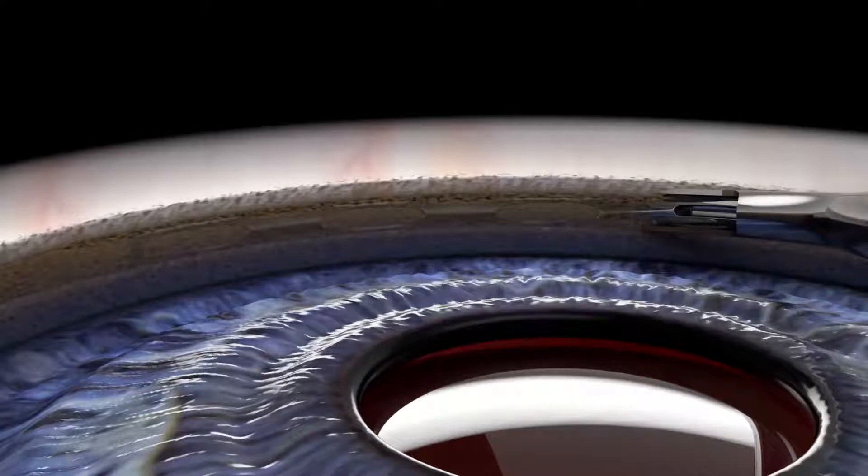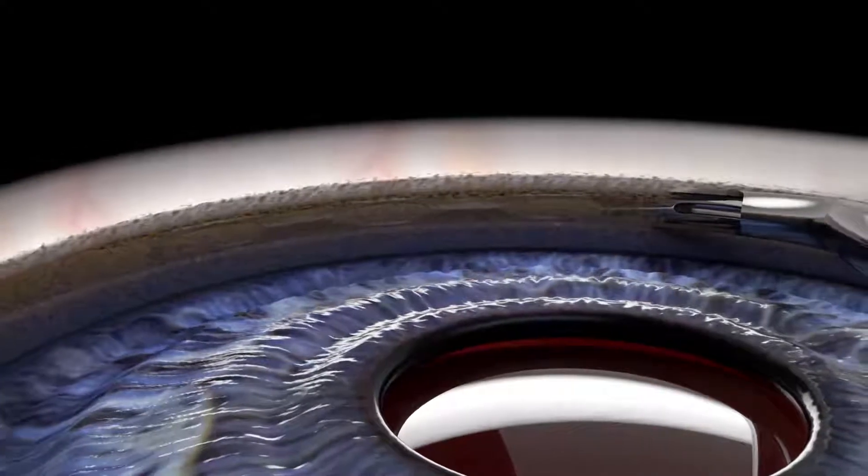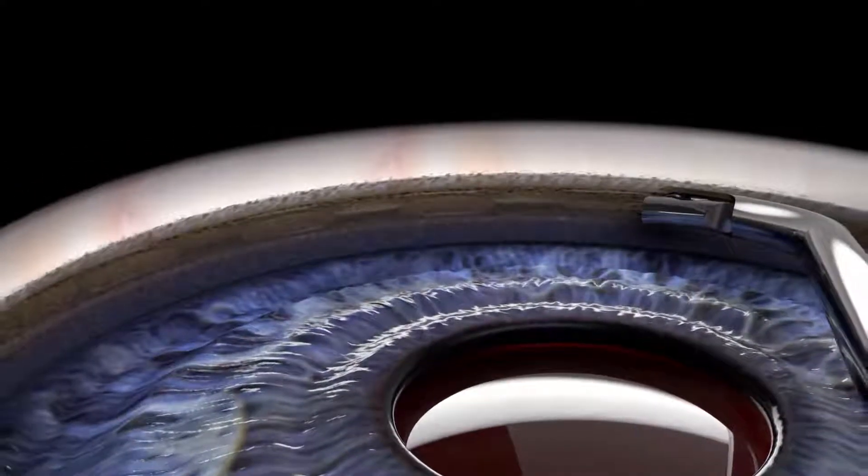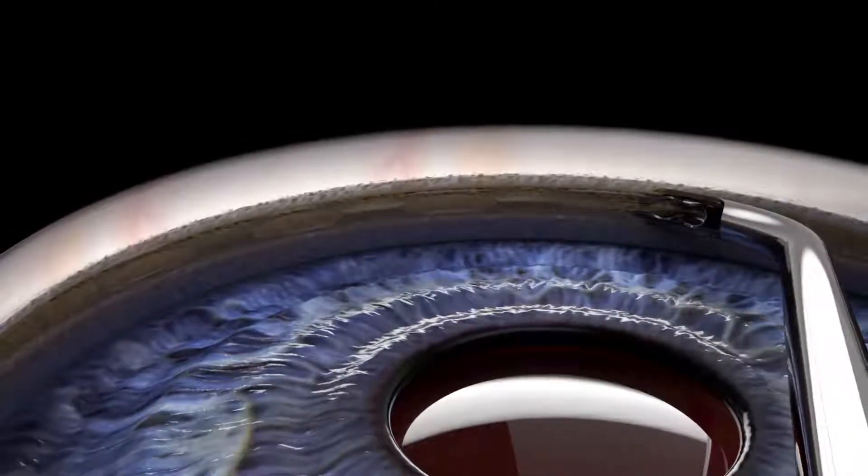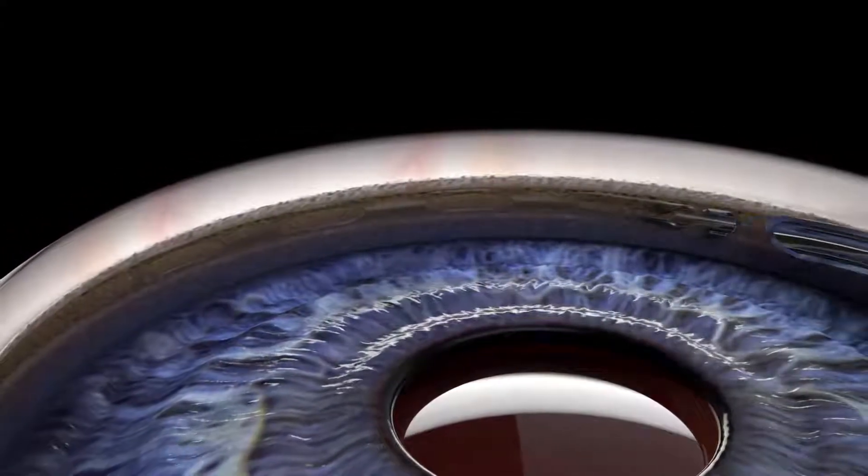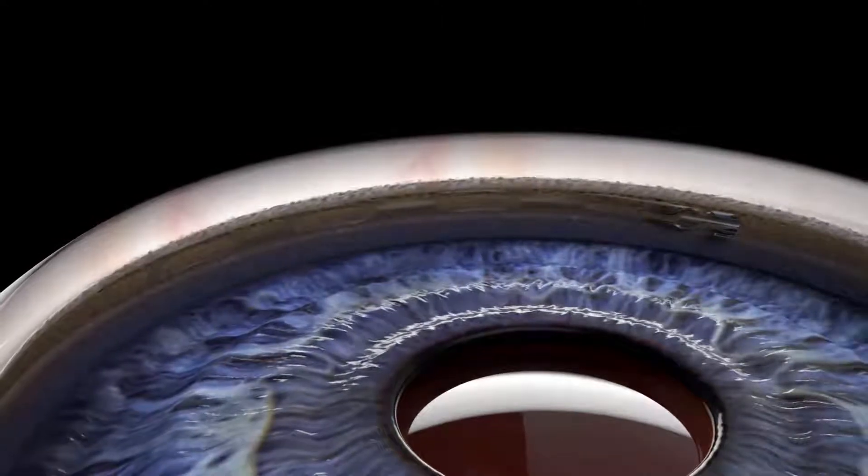Once satisfied with its position, the Hydrus is advanced until the microstent is released from the interlock. The Hydrus cannula is then removed from Schlem's canal and withdrawn from the eye.